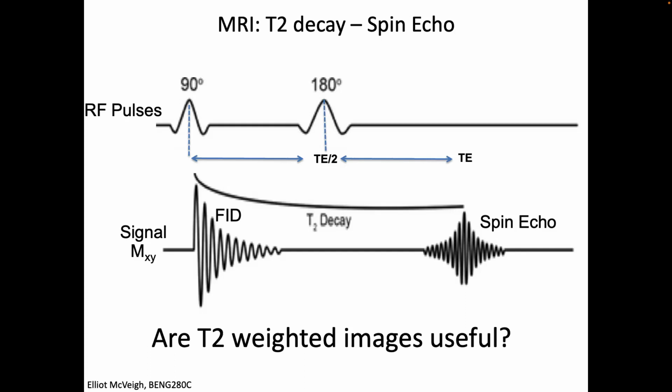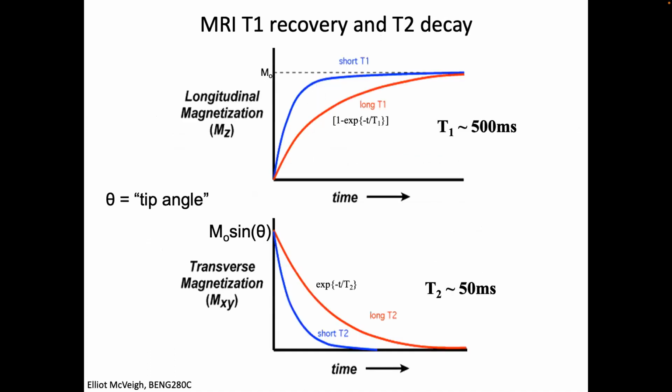My PhD thesis was actually on machine learning, using these features to optimize what kind of pulse sequence you should use to answer specific questions. Unfortunately, I didn't call it machine learning. I called it statistical decision analysis. That's what it was called back then. So it lives in obscurity because machine learning back then wasn't a thing. But the question is, if you really know what T2 is and you really know what T1 is, can you make any statements about the underlying health of the tissue?